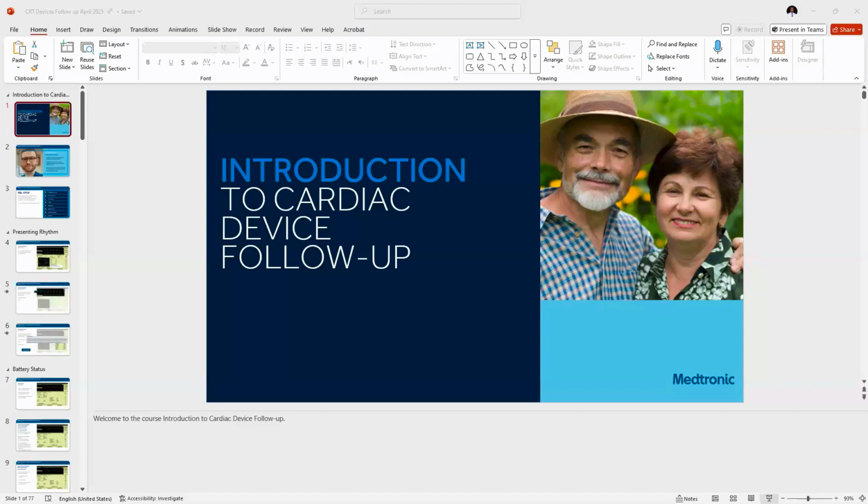For patients that have atrial fibrillation which is being conducted down to the ventricles, we have the conducted AF response, which helps to achieve good BiV pacing in those patients.